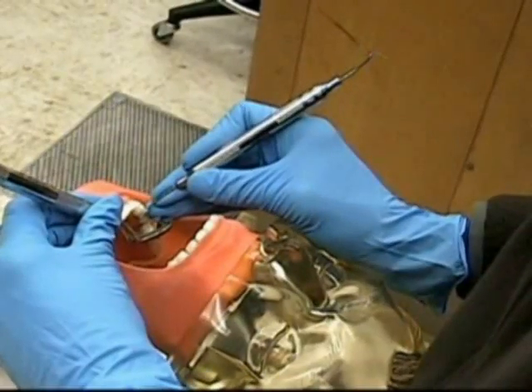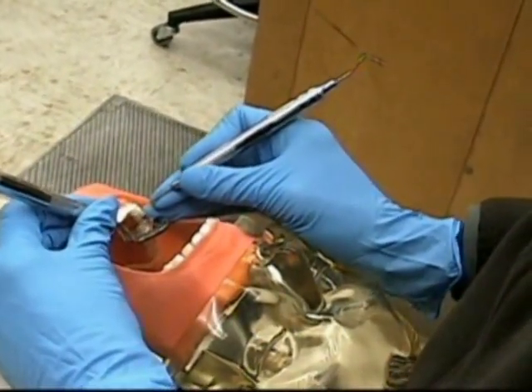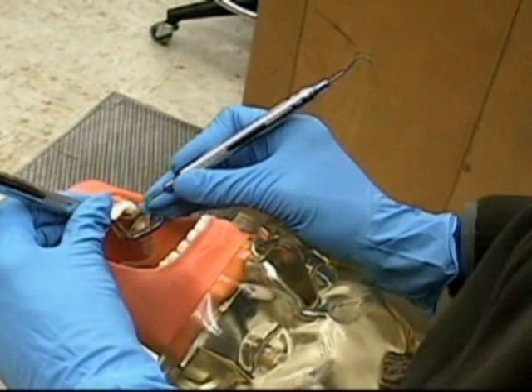All right, surfaces away from you on the lingual. Sitting so far back, use your mirror.